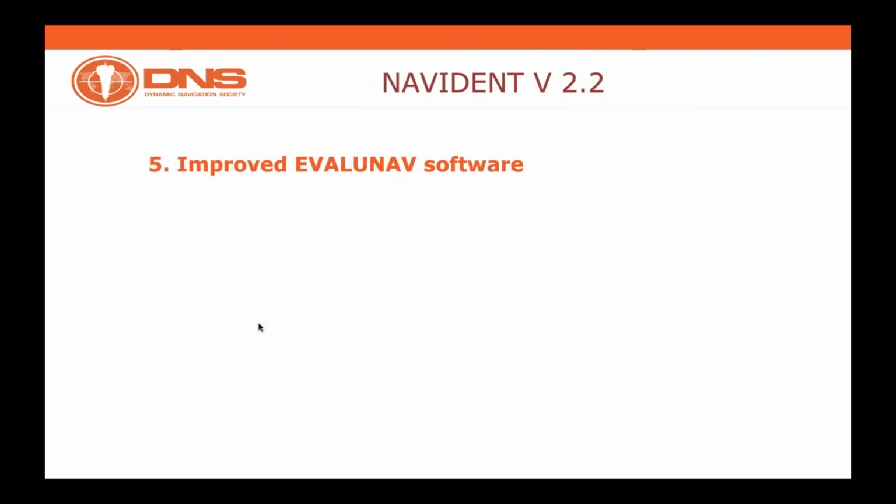There is another feature which is equally interesting. It's related to Evalunav. And Evalunav, as I said at the beginning, but I repeat here for those who joined us now, is a software application which is in the Navident ecosystem. It's part of the Navident ecosystem, but it's a software per se, and allows you to import a post-operative CBCT and a planned CBCT.